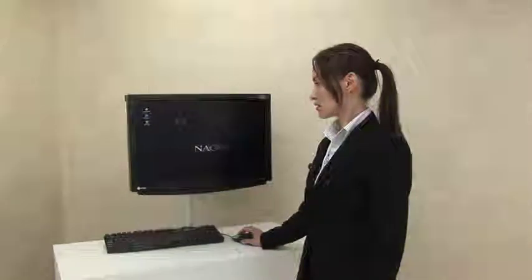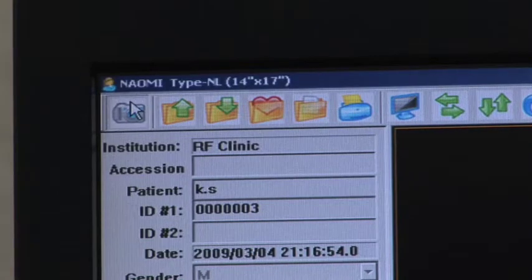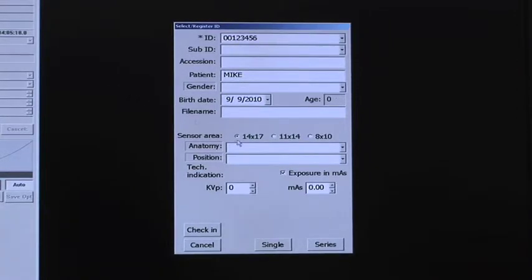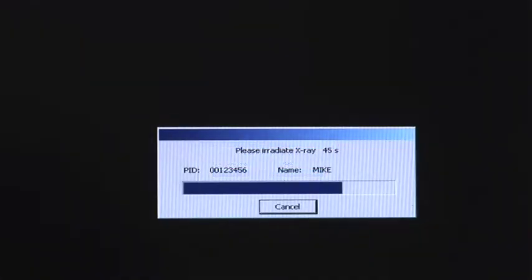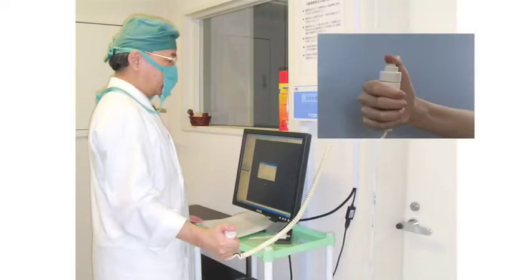Let's show you how to capture X-rays with the Naomi. On the Naomi software, click on the camera icon. Then the patient registration menu pops up. You enter the patient information like ID and name, and select the sensor area size that you would capture the X-rays on. You can enter the position or anatomy information if needed. Click on single or series when you are ready. Then the computer tells you that Naomi is ready to capture the X-ray. Once you confirm it, shoot the X-ray as usual. Once you shoot the X-ray, Naomi detects it automatically and starts downloading the image for you.